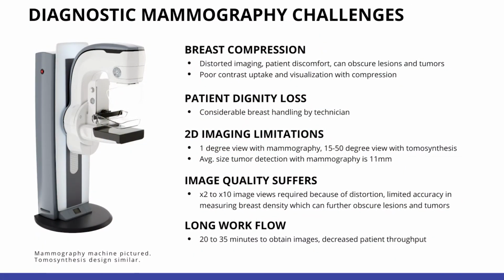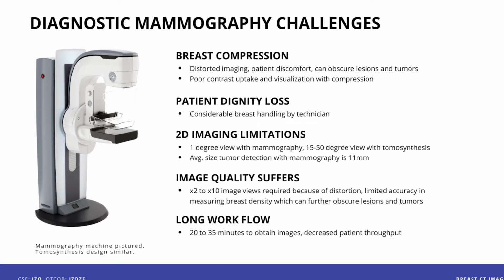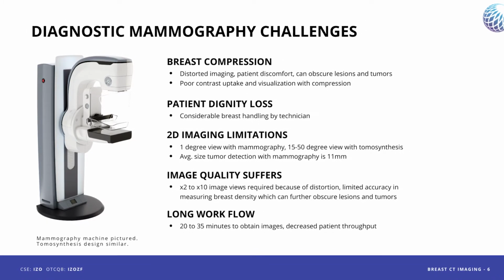You have a misshapen breast, you have one image, the image has to be at the right compression, and the technician really has to view it to make sure that each image is correct, or it has to be redone. And this can take up to 10 times, which impacts workflow, in that a woman could be there for 20, 30, 40 minutes even, getting her imagery done. And this impacts the time that the person has spent there, but also the number of patients a clinic can see, and lengthens wait times. And so this is the multitude of factors that we're trying to overcome.